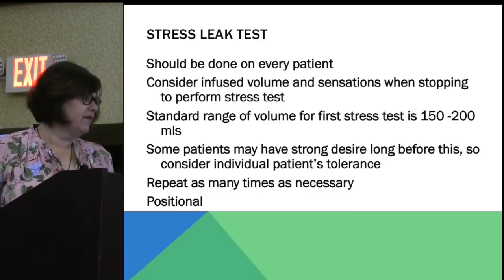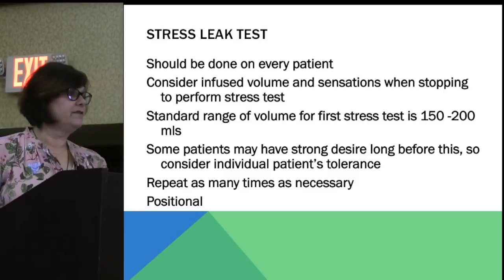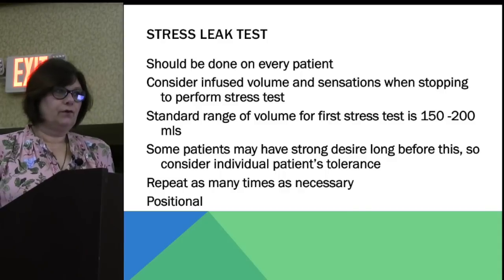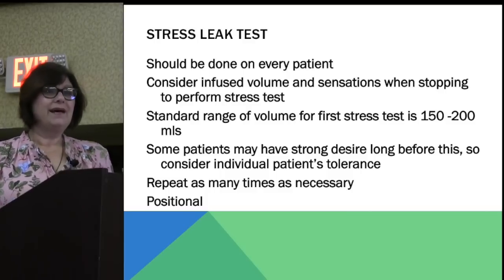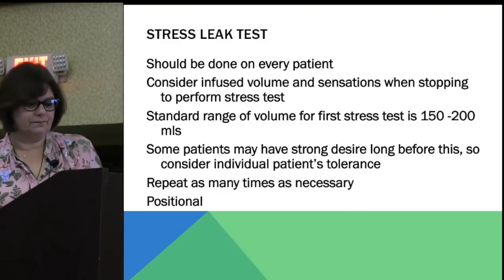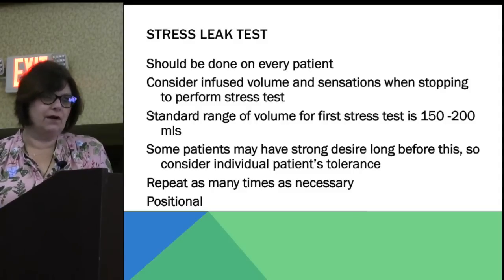Again, stress leak should be done on every patient. Consider the infused volume and sensations when stopping to perform the stress test. Some people, I say I stop at 150 to 200, but if people are complaining already at 50 mLs, 75 mLs, that they really feel full, you're probably not going to wait to 150 to 200 mLs to do your stress test, because this is someone who's not going to be able to hold. 200 might be their full capacity, right? And you want to take every opportunity to know if they have stress incontinence. That's what they're here for.